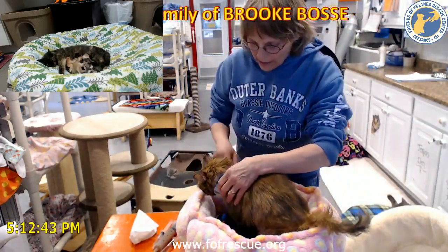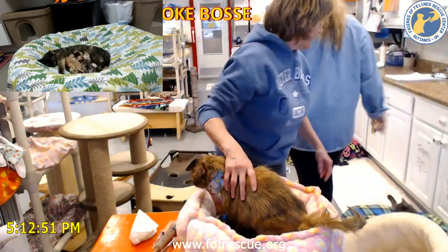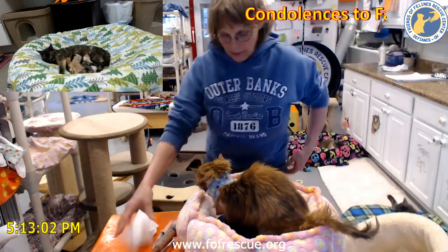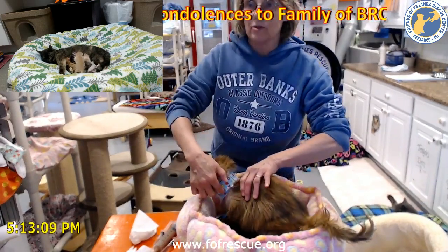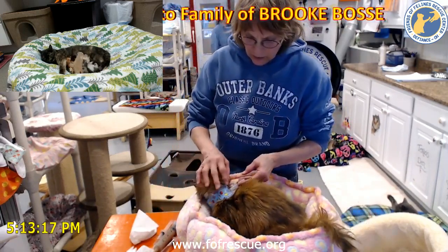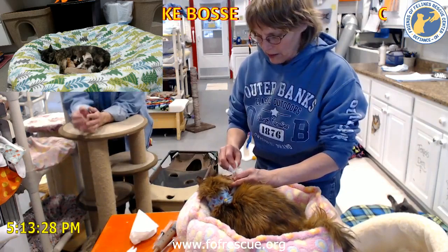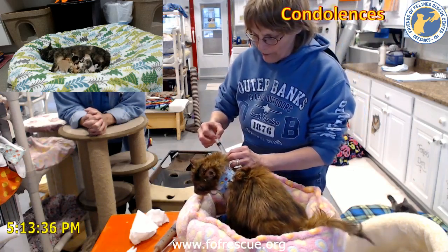So, Mowgli, I am quite sure a lot of you folks have done tube feedings before. I know some of you have, but for those that haven't, her feeding tube hangs over on her right side, but it actually goes down into the esophagus. And I'm trying to feed her without taking this off, because if her tube comes out, we won't be able to do another anesthetic on her. So we have to make sure this stays in. I always just flush it out first with water, just a little bit.